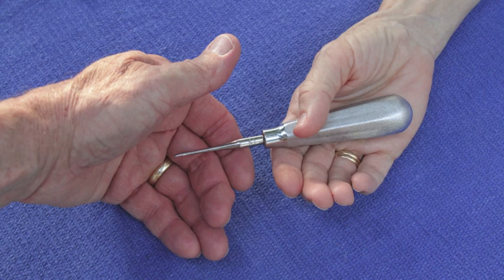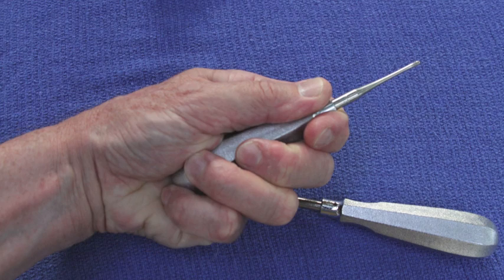In these last two images, you can see how the surgeon will usually hold the instrument, usually by the palm or possibly by the modified pen grasp.